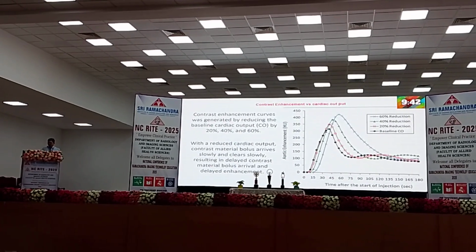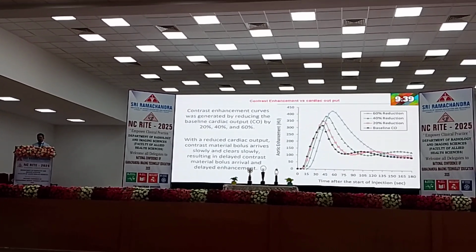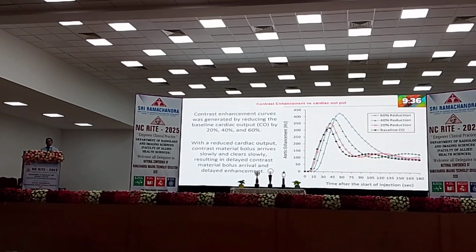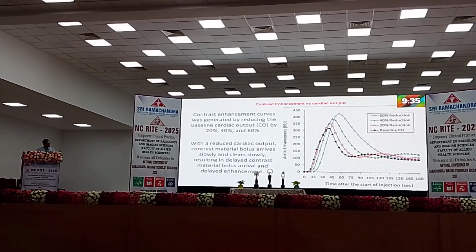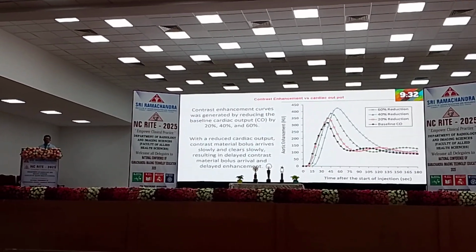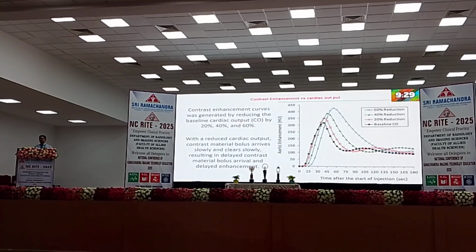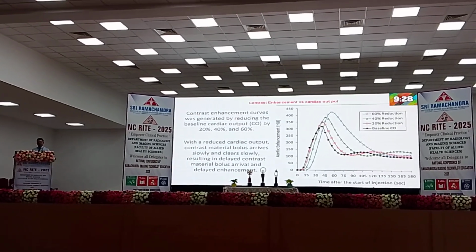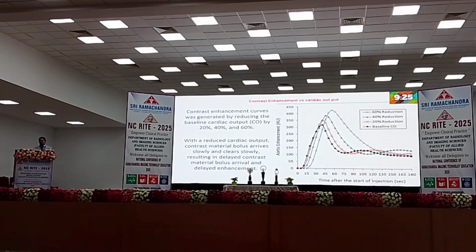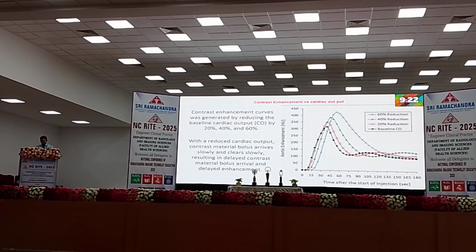So next one, regarding cardiac output. I had a study in this, and there are 3 studies published in this article related to cardiac output. Whichever patients are coming to our department, as I see, most of the patients have a normal cardiac output, so we didn't find much variation. But this one I adapted from one of the published articles in the journal.